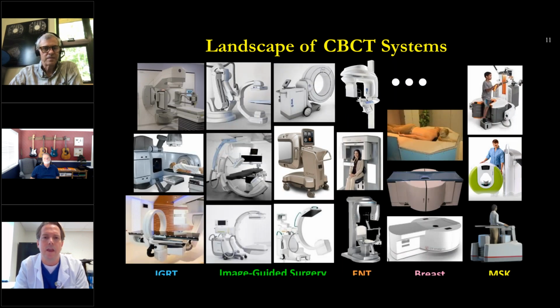And the landscape that has emerged based on that technology over the last 20 years is pretty broad. This drawing just shows a few of those over a spectrum ranging from image-guided procedures in radiotherapy, surgery, or interventional radiology, through to diagnostic imaging in dental, ENT, breast, and orthopedics and musculoskeletal.